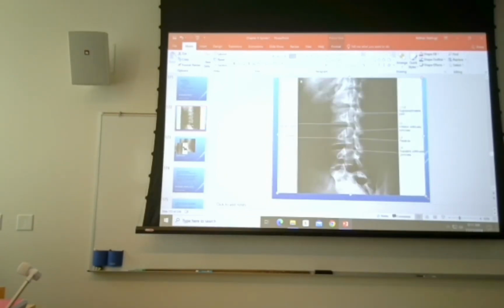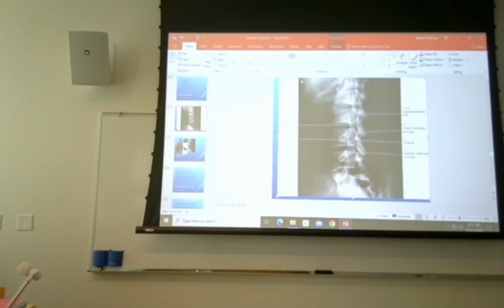So you're going to develop an eye, being able to pick out things. And if you see some oblique L-spine views and you don't see this, don't get too upset about it. If you can't see the kidneys yet, don't get too upset about it.